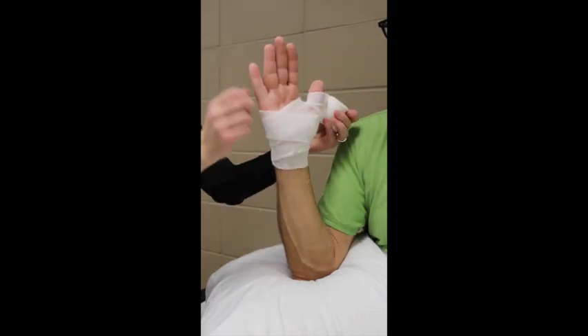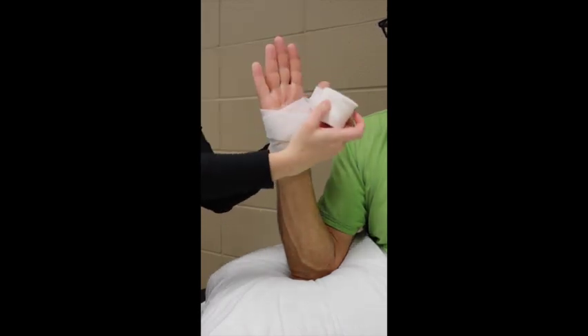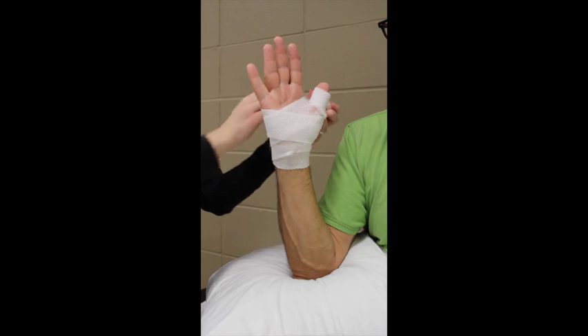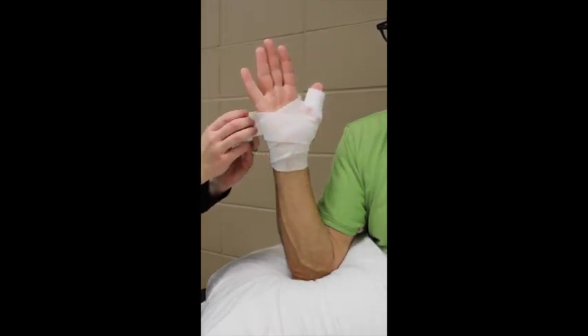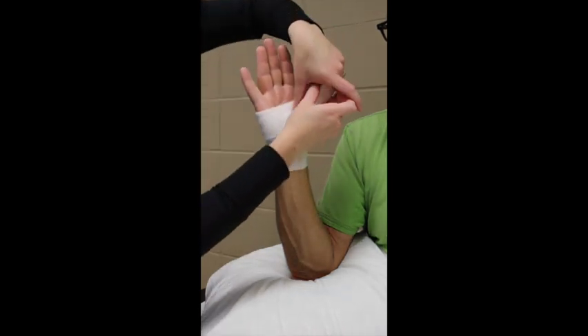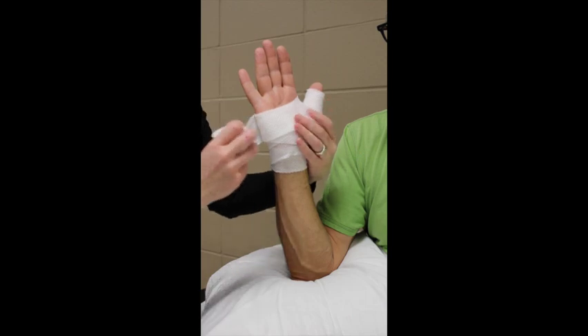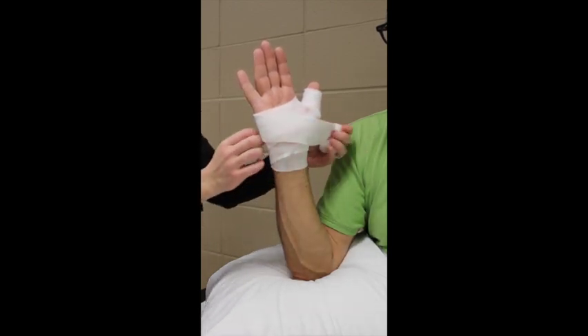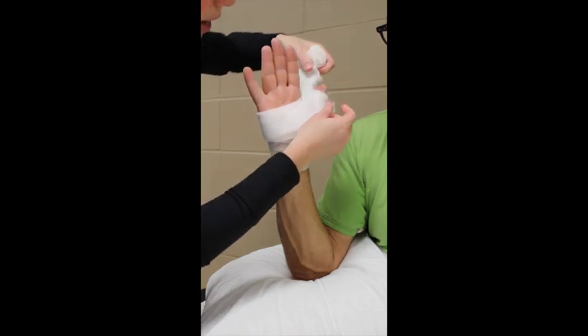Again tearing from the bottom to go around the thumb through the first web space, go around the thumb again tearing from the bottom. There should be no tension in the padding. I have now gone around the thumb three times. Now work your way back down and around through the first web space to cover any gaps.